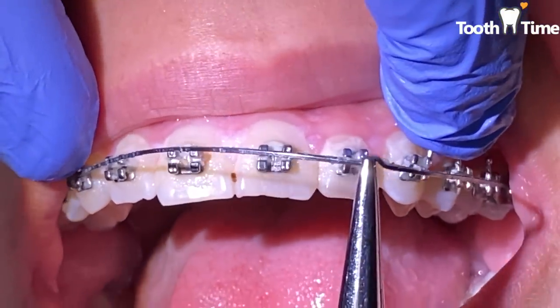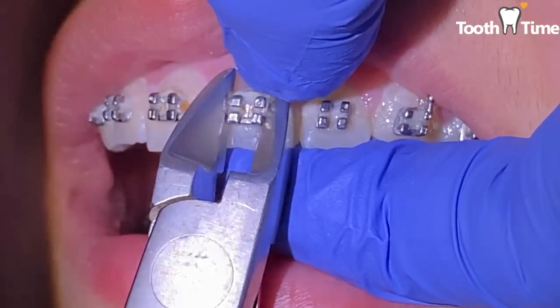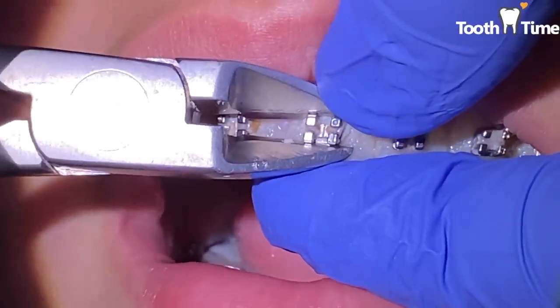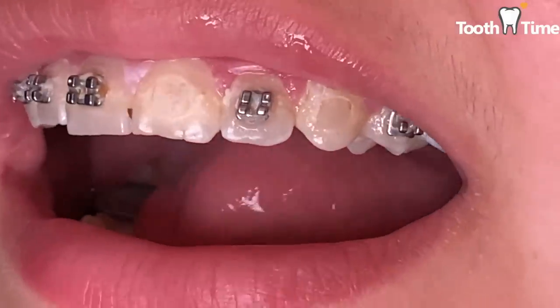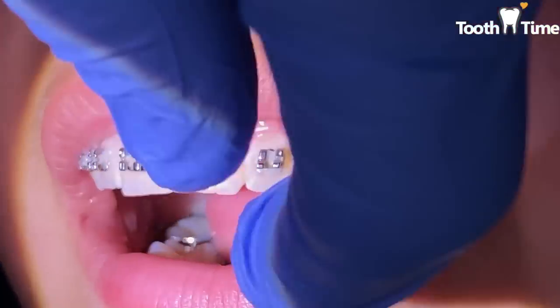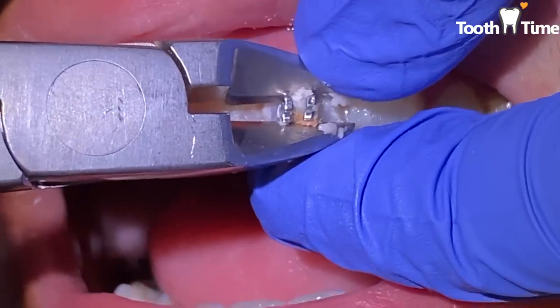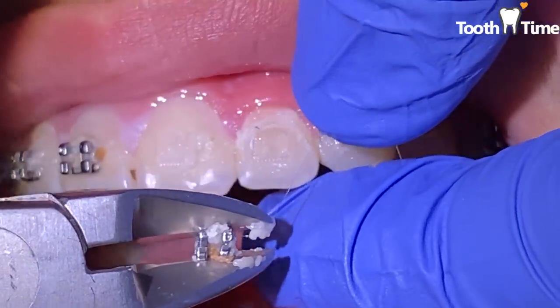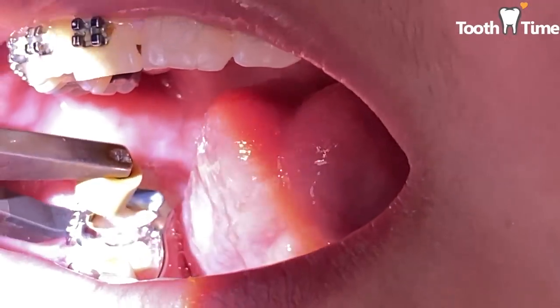First, we're going to remove the brackets because we need to reposition teeth. What that means is that the root of the tooth is rotated either distally or mesially — meaning left or right or front or back — and we need to adjust the root to help align the teeth better. If you do not reposition teeth, sometimes you start to cause root resorption, which is deterioration of the root.